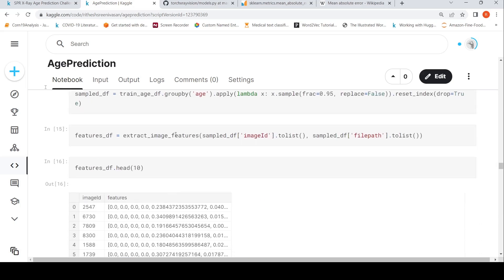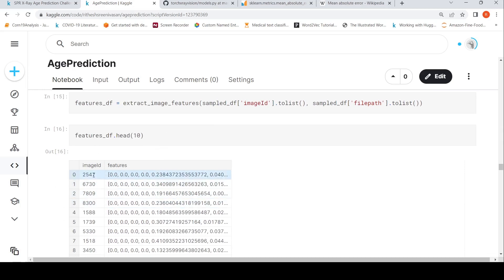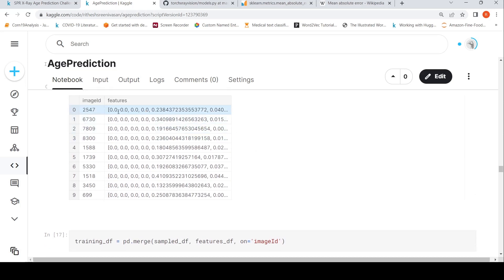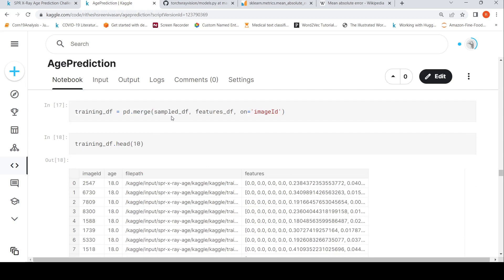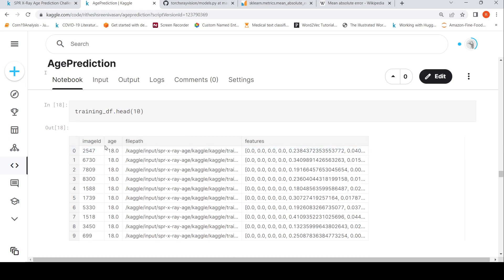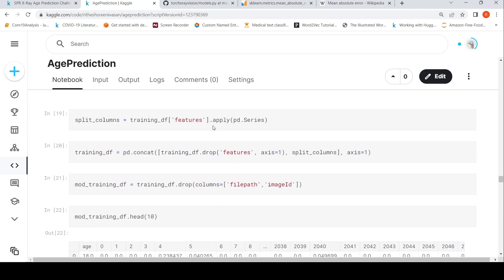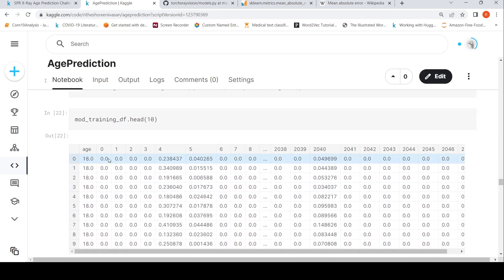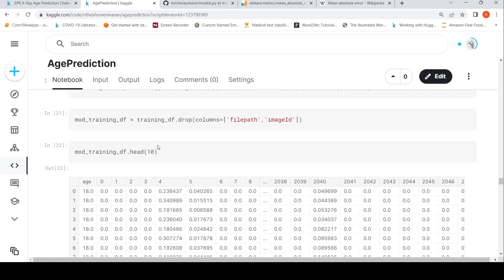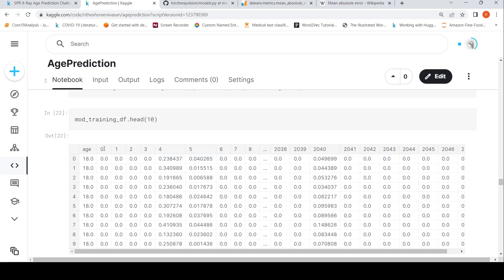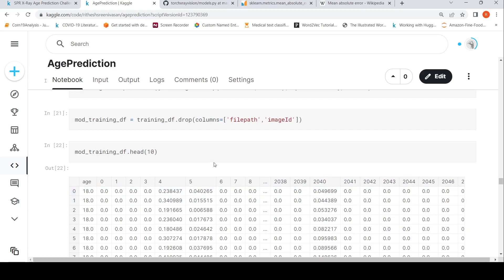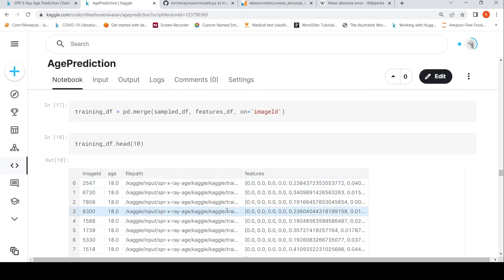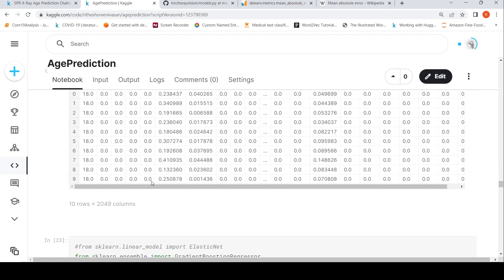The features are extracted and the result is a data frame with image ID and features. I merge the features with the original data frame containing age, then split the features column into individual feature columns — F0, F1, and so on — yielding 2048 features total. I drop the file path and image ID columns since I only need age and the features.